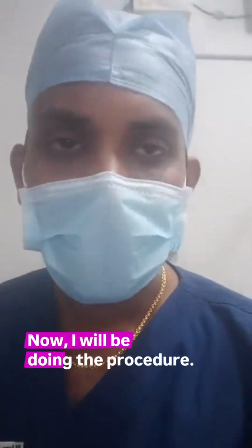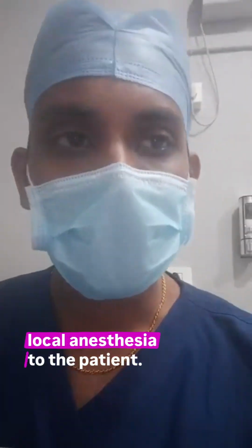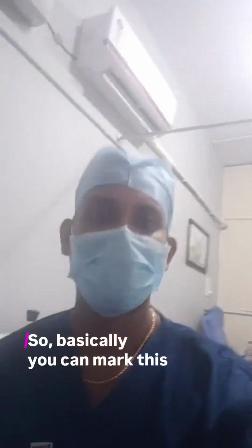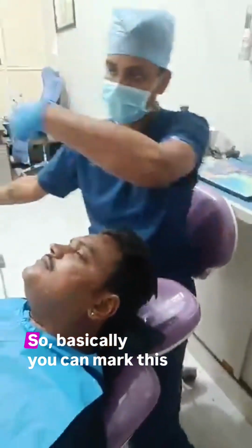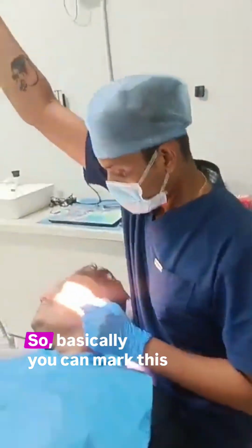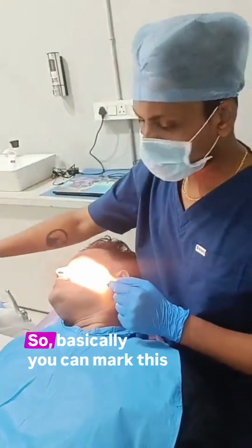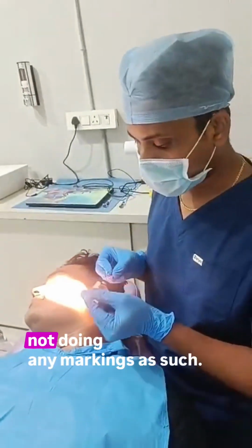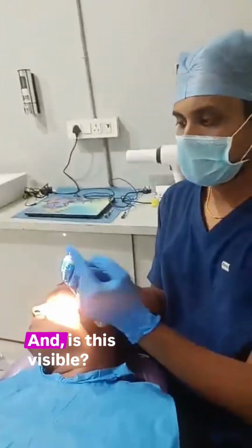Now I will be doing the procedure. Already I have administered the local anesthesia to the patient. Now you can see the procedure I am going to do. Basically you can mark this area. You can do the marking, but I am used to it, so I am not doing any markings as such.